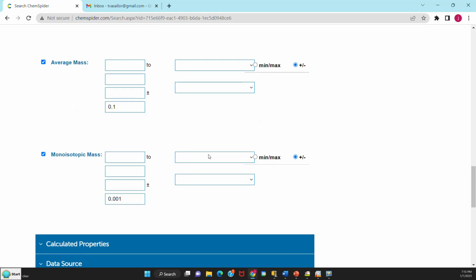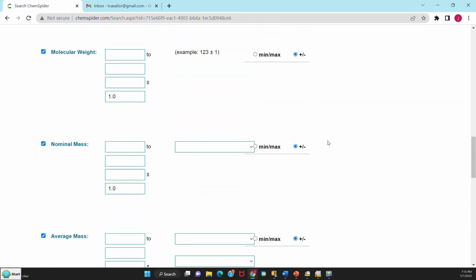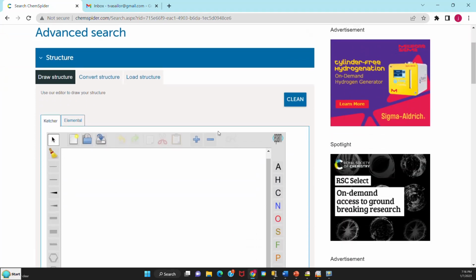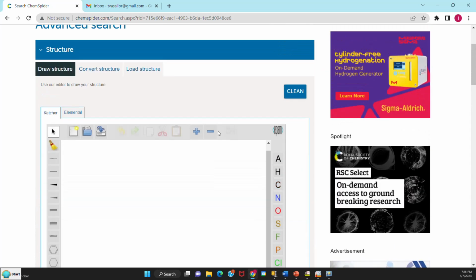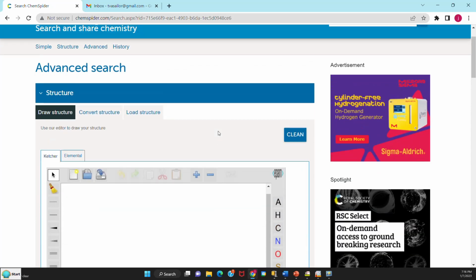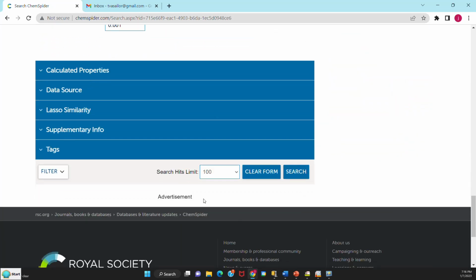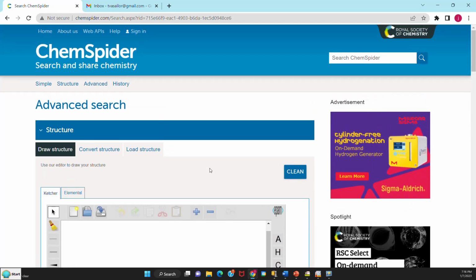Sometimes this program takes a little longer than one would like, so be sure to be patient with it at times. So that's pretty much the basics of using the program properly. The other thing is sometimes the screen flashes or you're on another window. Usually you're going to see the results at the bottom down here, so you have to scroll down to see what it's done. But sometimes you might miss that.